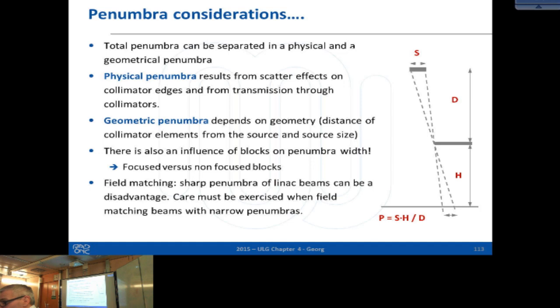But we also had some kind of mechanical tools that need to be inserted, and then with some physical force you could turn these emergency buttons and get the source back. And all that is for brachytherapy. It's the same way: if the source doesn't move back, you need to do something to get it back. So you saw an afterloader with this wheel and so on, and then you saw the container, and the tweezers to grab the source. So 1/r² distance in practice.